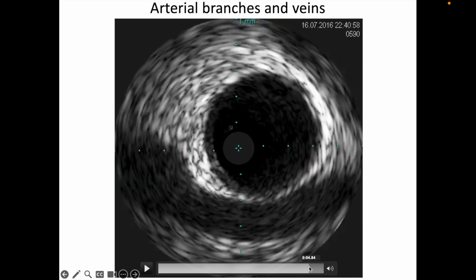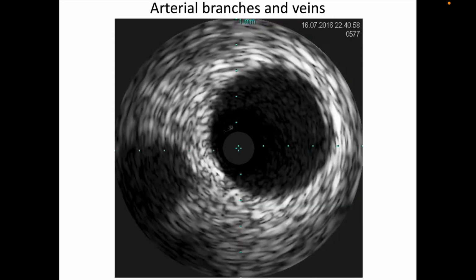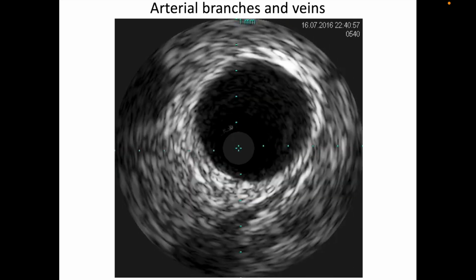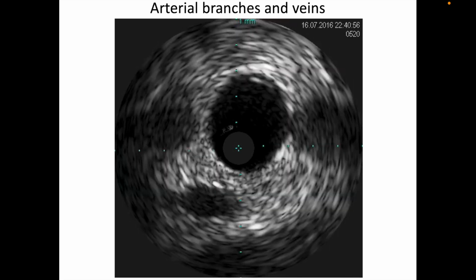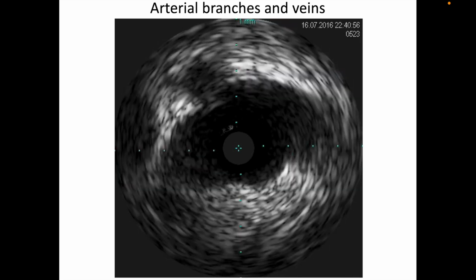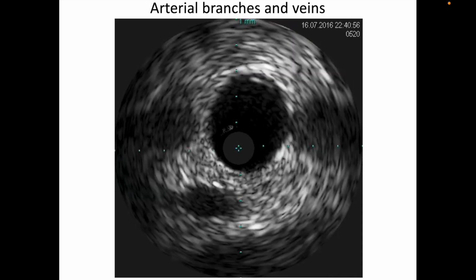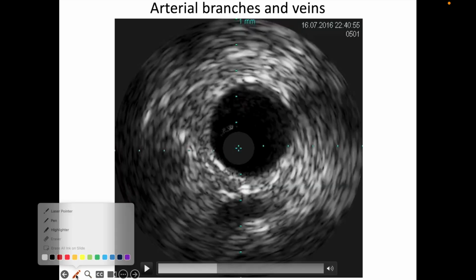You see this? That's a vein at 6 o'clock running all the way from 9 o'clock to 3 o'clock position. That's a vein. And then going back, and there, two branches coming in on both sides, and there they open in. So that's a trifurcation. You see this? That's a trifurcation. Both branches were opening into it. So I'm going to put my pointer back.